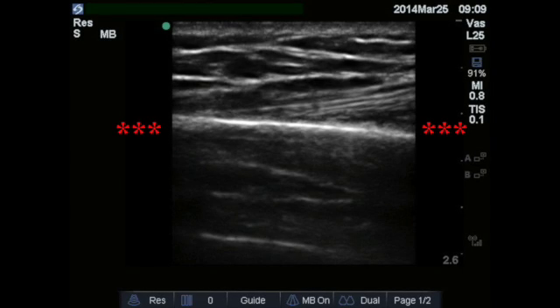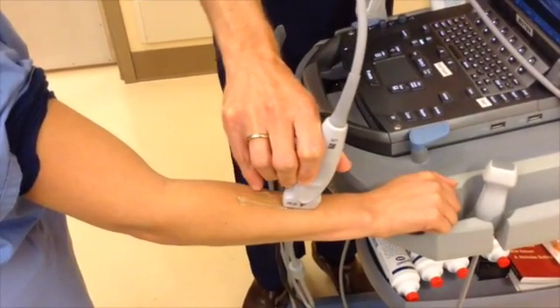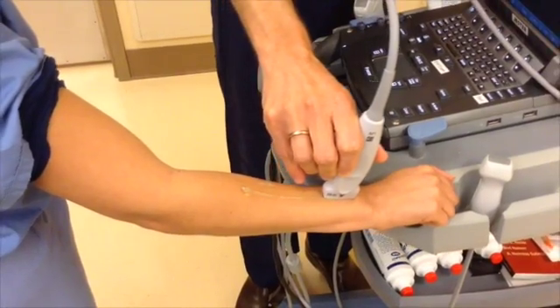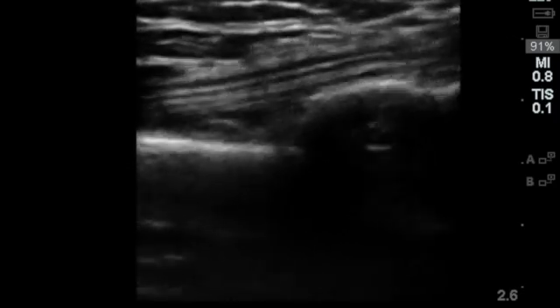Here is another example of bone cortex. Track along the bone towards the fracture, which will be seen quite clearly whether it is subtle or substantial. After finding the fracture, align it in the center of your field.